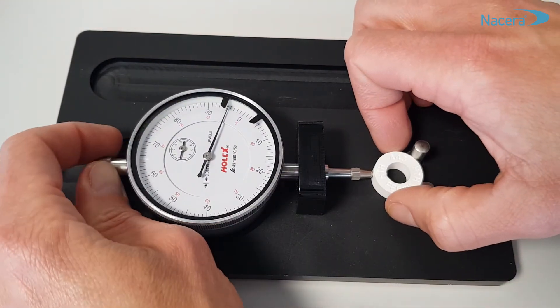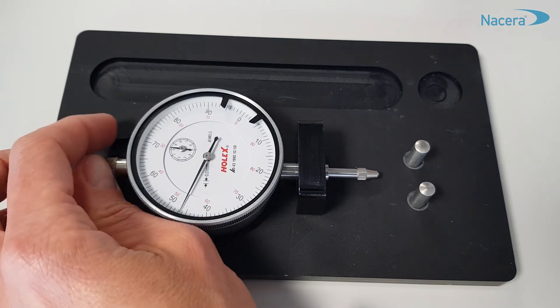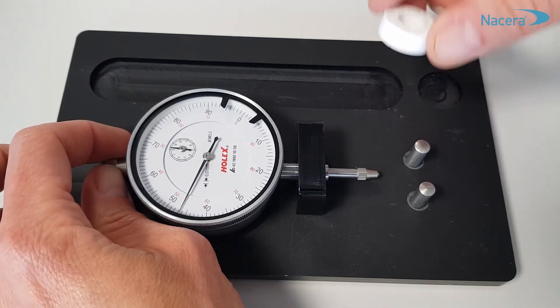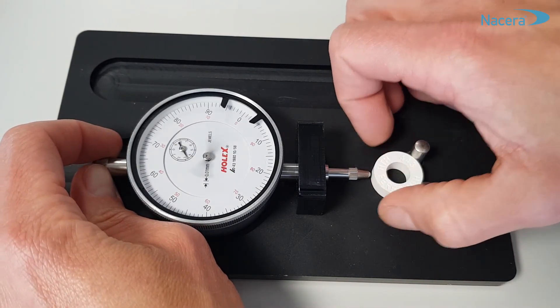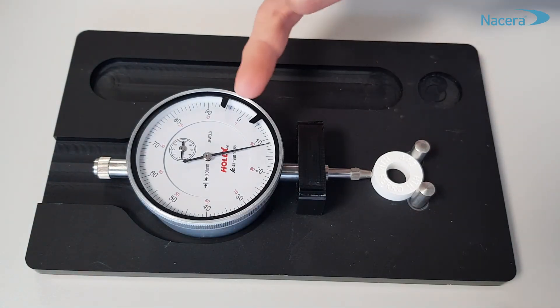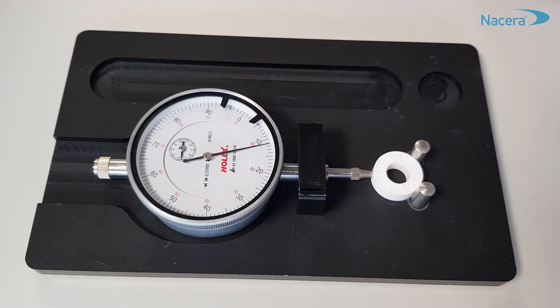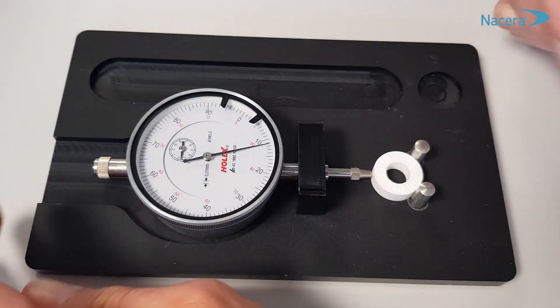Let me illustrate by another example. If on the contrary the deviation is observed on the right from zero, like here — 11 scale marks corresponding to 22 degrees Celsius — the sintering temperature will have to be increased by 22 degrees higher.